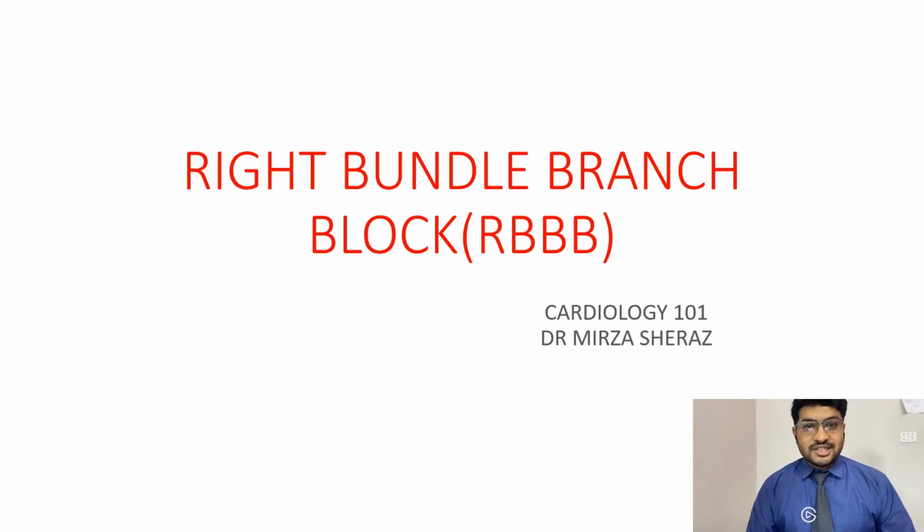This is Dr. Shiraz, and today we are going to learn about another conductional delay, that is right bundle branch block. As we discussed in the previous lecture on left bundle branch block, conductional delays, for example left bundle branch block or right bundle branch block, commonly accompany some heart pathologies, and we should look for that. They also make the prognosis for that heart pathology worse.